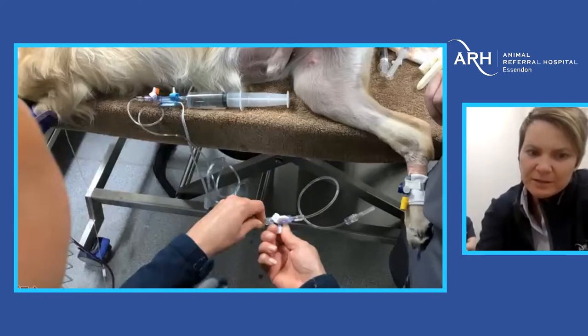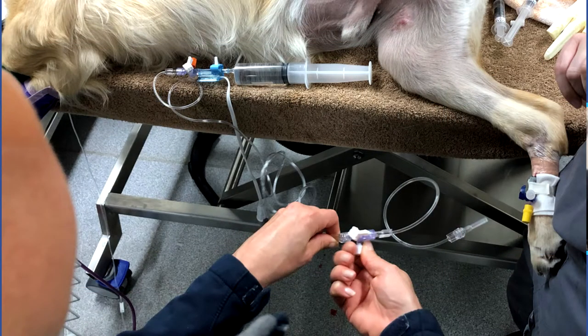To clarify the three-way tap procedure: it's not the three-way tap at the patient side — it's the one halfway along the semi-rigid tubing. Turn that off to the patient, remove the little white cap so it's open to the transducer, go through the zeroing process, press zero IBP, wait for three zeros, then turn it back off to the outside world and replace the white cap.